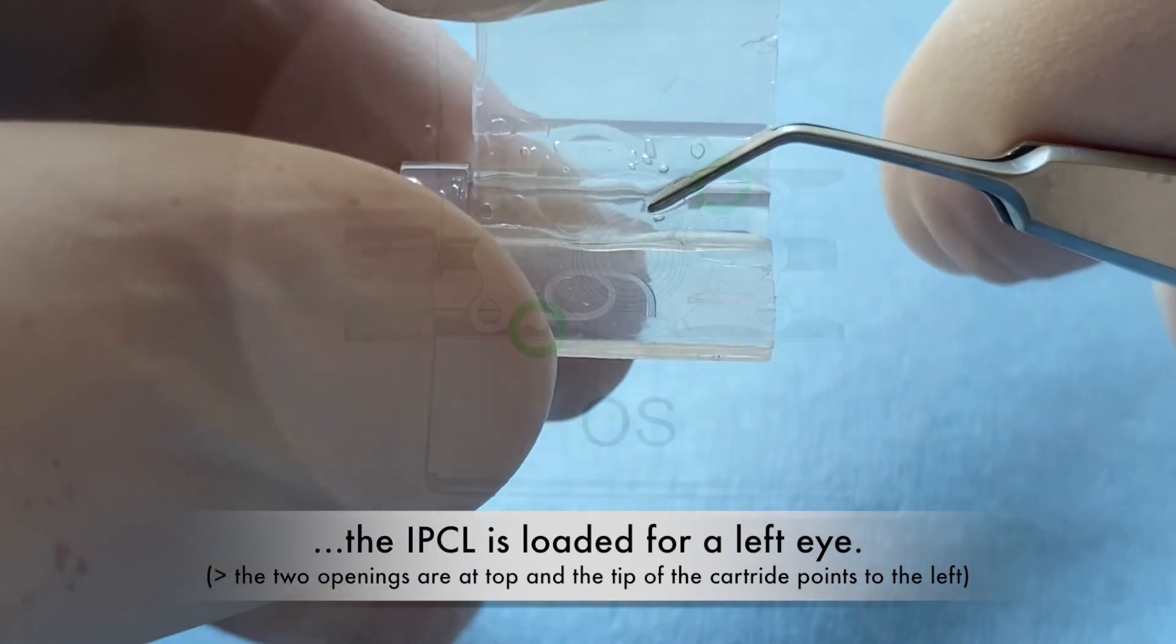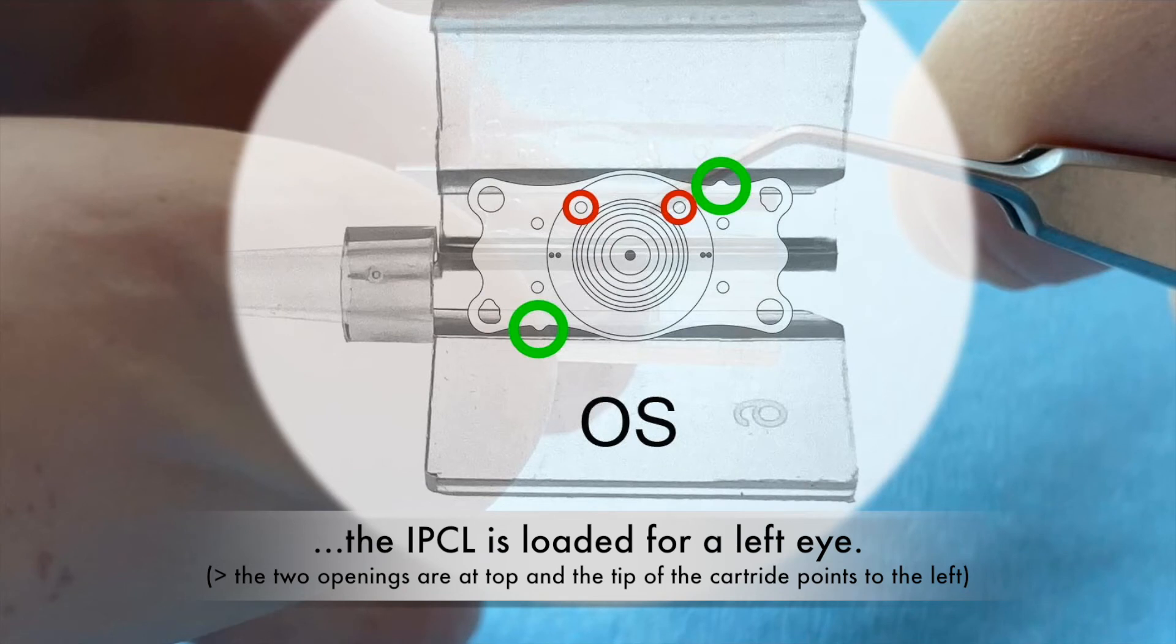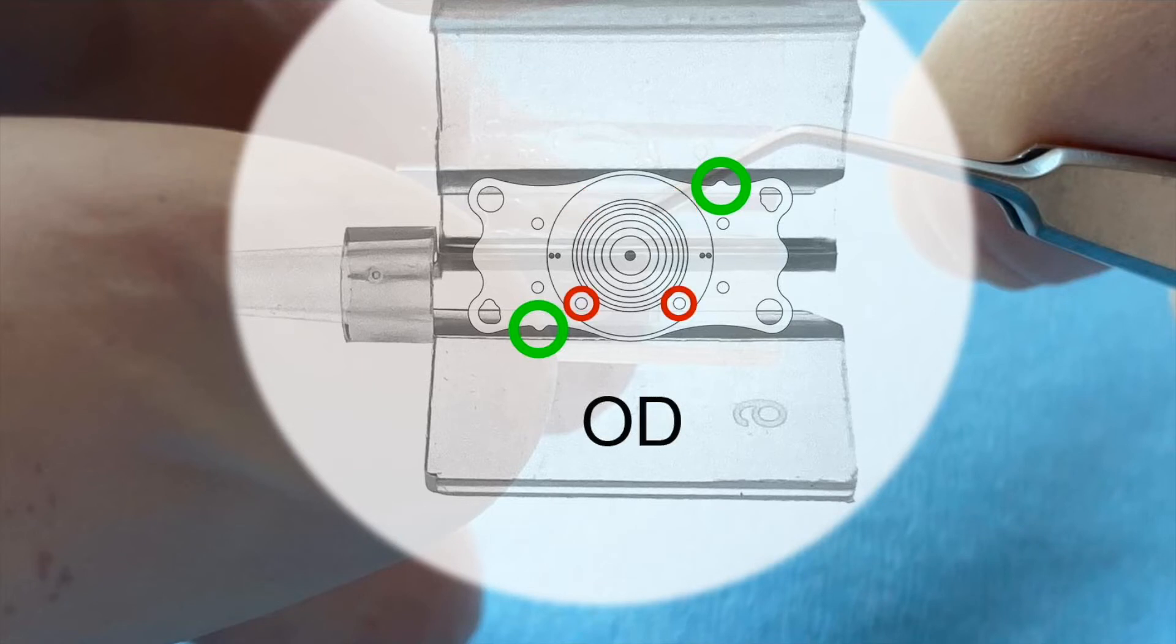The two openings are at top and the tip of the cartridge points to the left. For a right eye, the two openings should be at the bottom or the tip should point to the right.